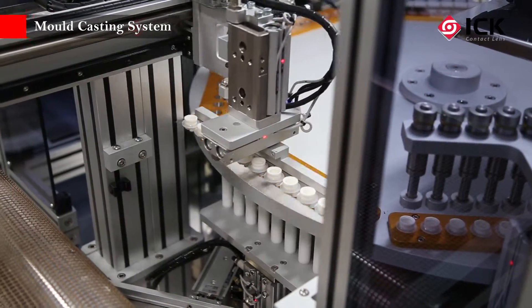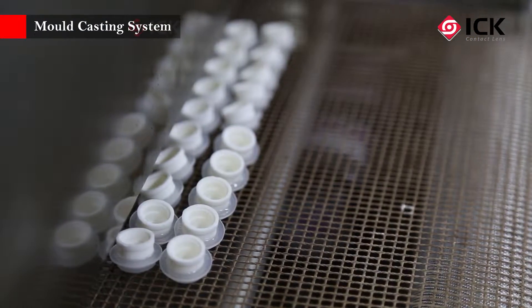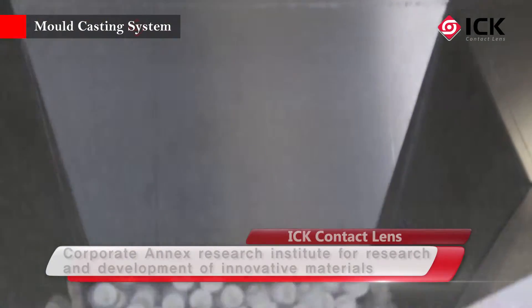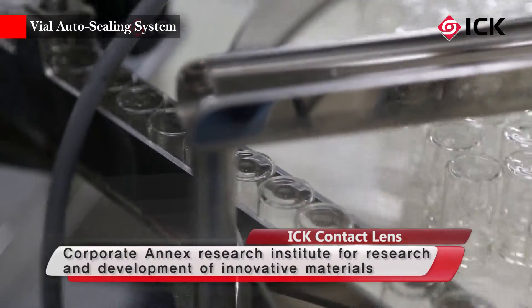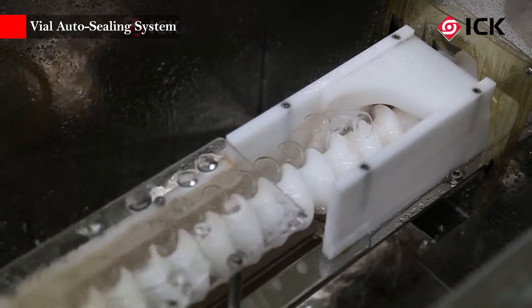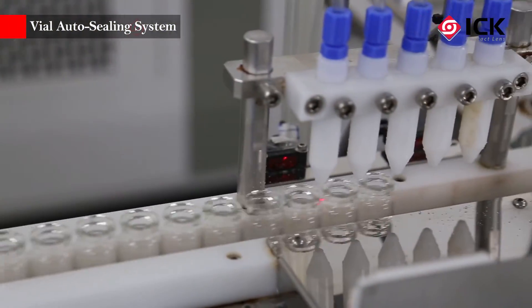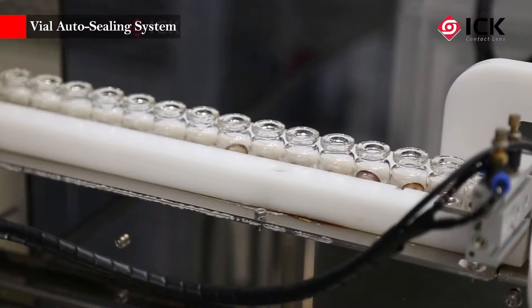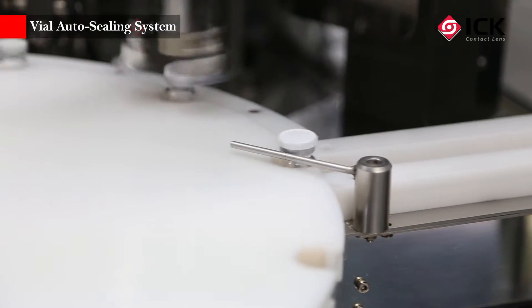ICK is a contact lens manufacturer that continuously strives to produce comfortable and healthy looking contact lenses. The silicone hydrogel contact lenses developed by in-house technology with innovative materials at the company Annex R&D Center offers high oxygen permeability, excellent protein non-adherence, consistent comfort and moisture for your eyes all day long without irritating deposits.